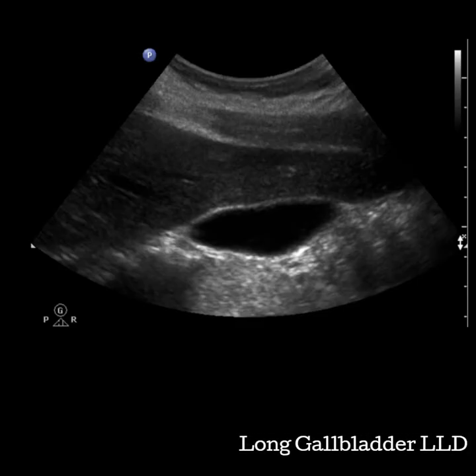Roll your patient onto their left side. Make sure that they are all the way up onto the left side and not kind of angled back towards you. Label this image as decube or LLD for left lateral decubitus. Watch for small mobile debris or movement of pathology after rolling.